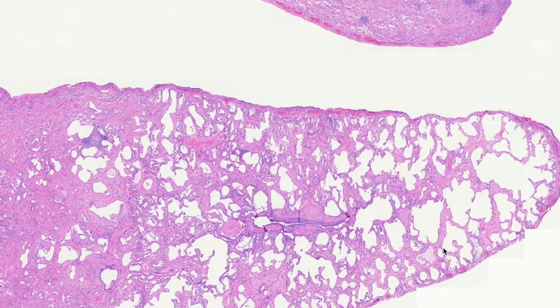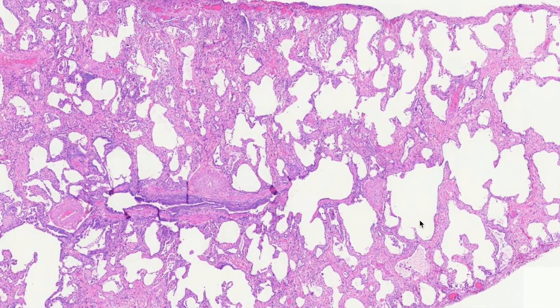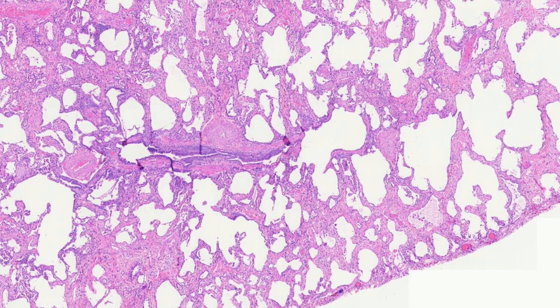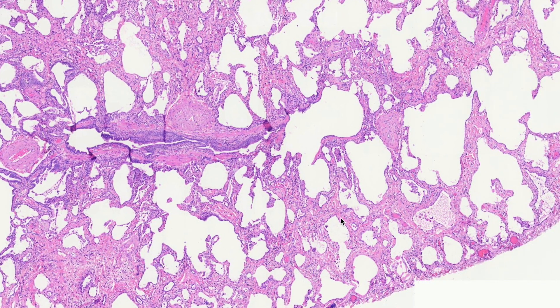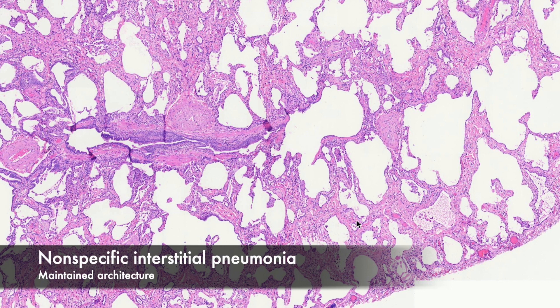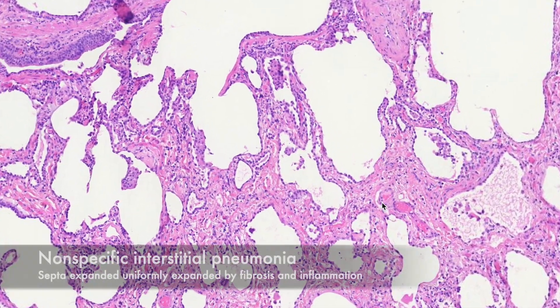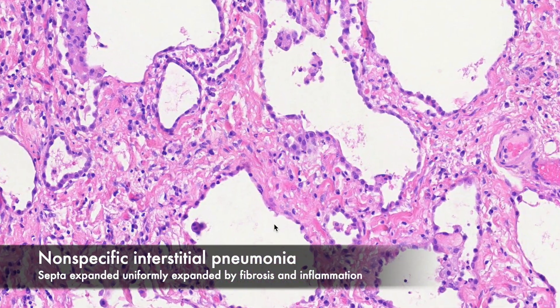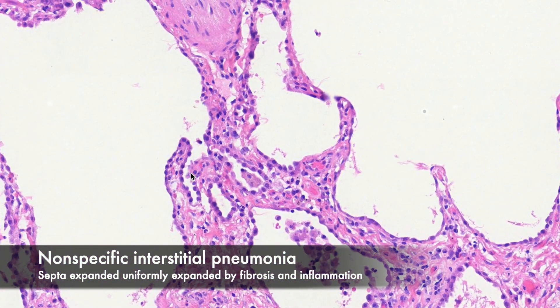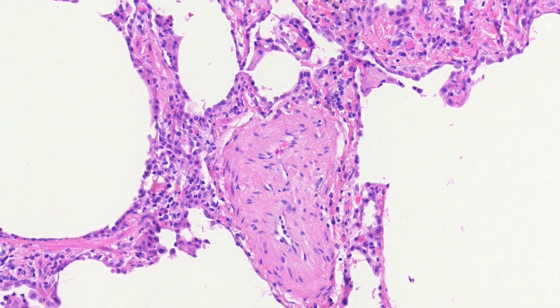At intermediate power in a better-preserved area, you'll notice that the alveolar architecture is largely maintained. We're not seeing big areas of architectural distortion or microscopic honeycomb change that we'd see in cases of usual interstitial pneumonia. When we go down a bit further, we can see that the alveolar septa are really intact, except they're expanded — expanded by both fibrosis as well as a mixture of chronic inflammatory cells diffusely expanding the alveolar septa.